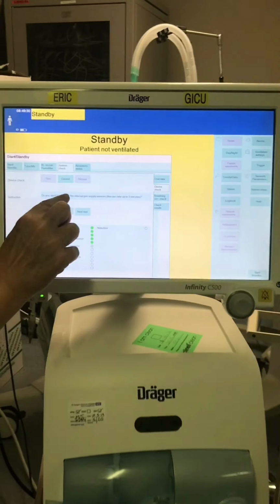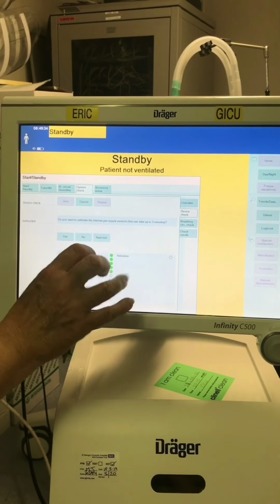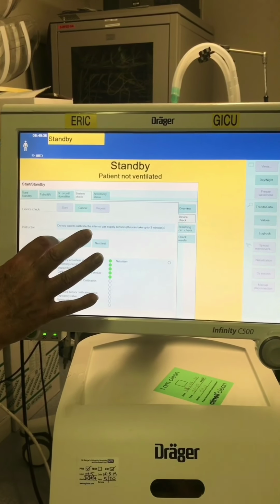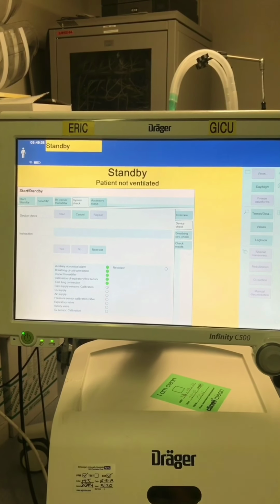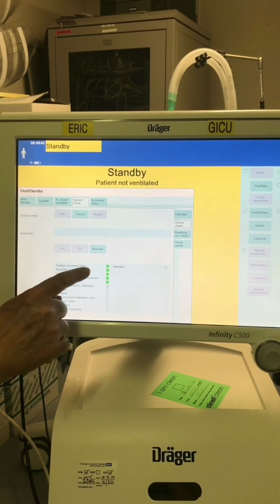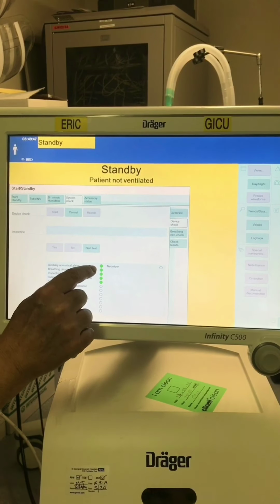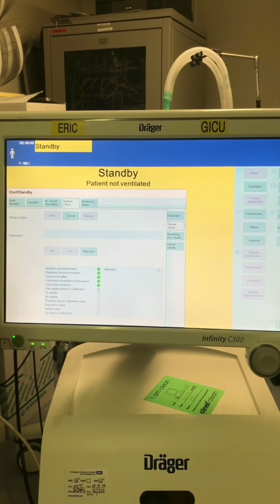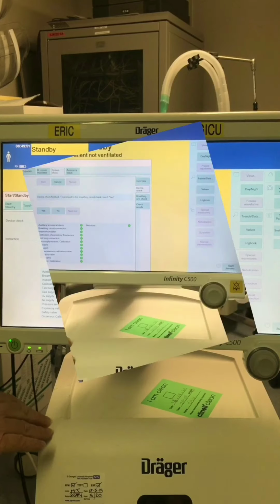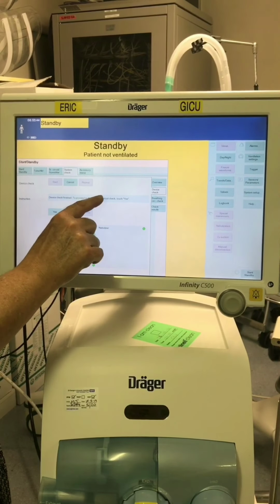Do you want to calibrate the internal gas supply sensors? There is a note here that it can take up to 3 minutes, but we are doing it between patients. Yes. As you can see, whilst it's performing this test, every time a test is performed and passed, we have a green filled circle to say that that test is complete. Okay, it says the device check is finished, and to proceed to the breathing circuit check, touch yes.